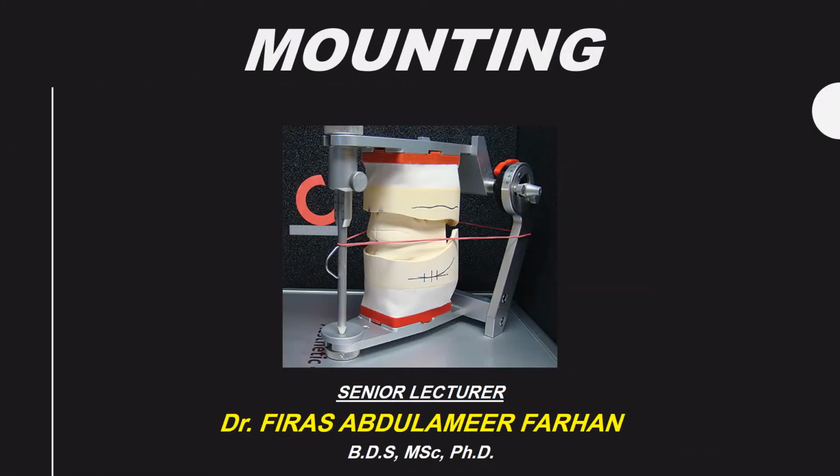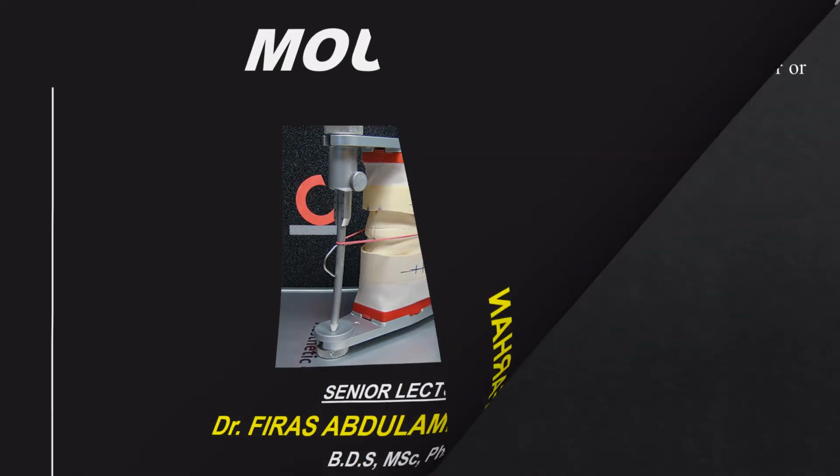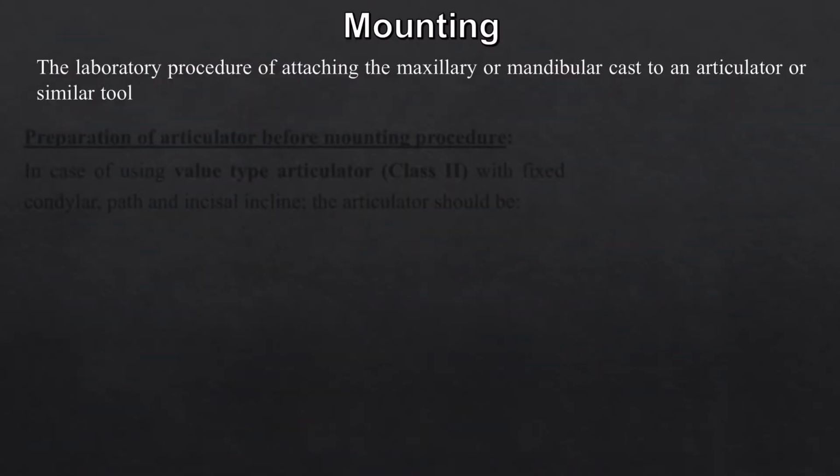Assalamu alaikum. Today our lecture is mounting. Mounting is the laboratory procedure of attaching the maxillary or mandibular cast to an articulator or similar tool.